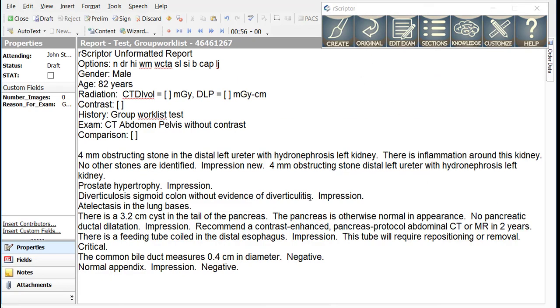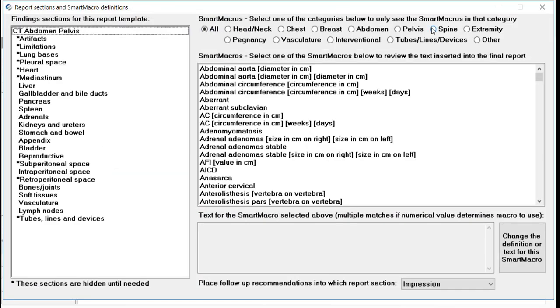We are now going to discuss R-Scripter smart macros. Before we begin, it is important to note that if you have been using macros in your dictation software, you can continue to use these in R-Scripter. To see a full list of available R-Scripter smart macros, simply click on the Sections button in the R-Scripter interface. On the right, you will see a complete list of available macros and how to use each macro.